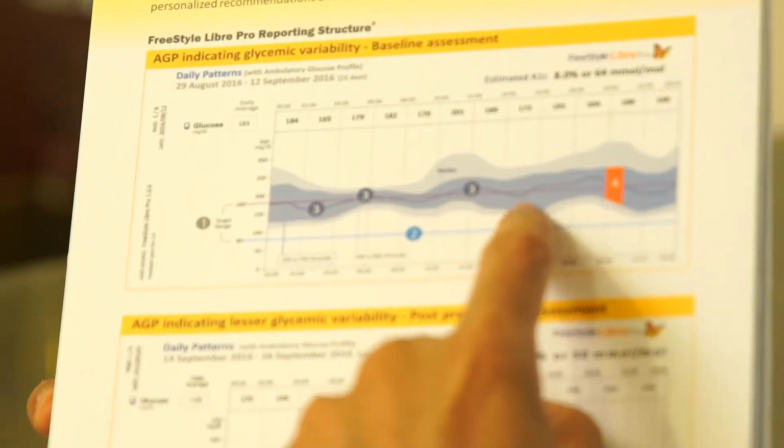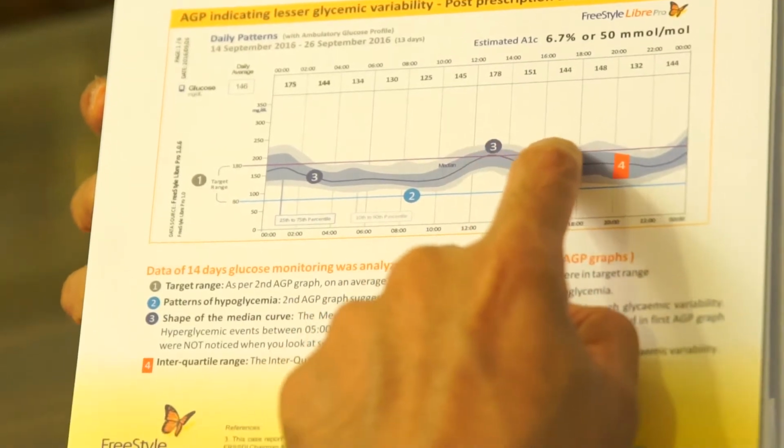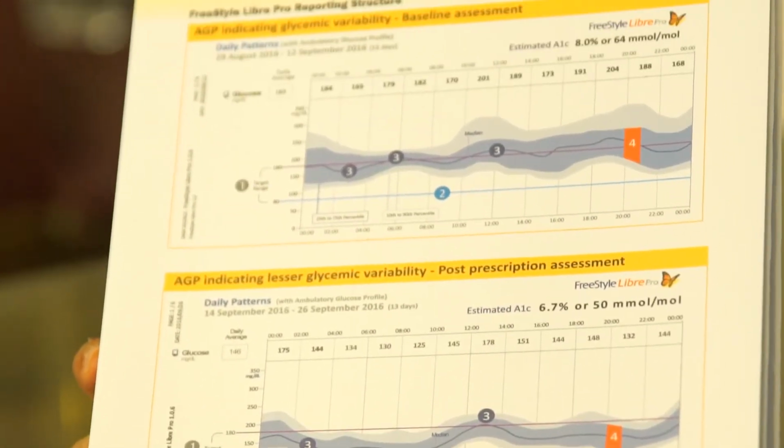This is not a diagnostic test alone. Generate an ambulatory glucose profile report. Make changes in diet, in physical activity, in medicines, and then again see the report, and the patient can see his or her own blood sugar patterns changing. So you are able to see what was happening to you earlier, and you are able to see the immediate results of a therapeutic or a lifestyle-based intervention that you have given.